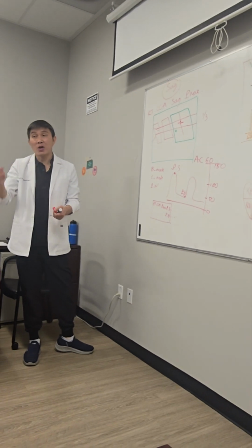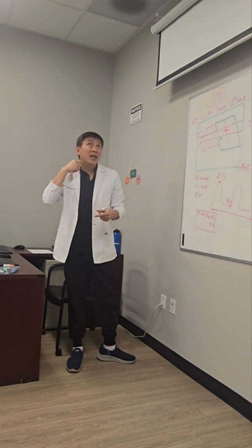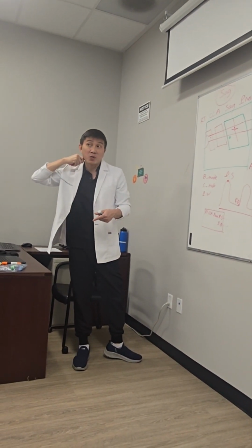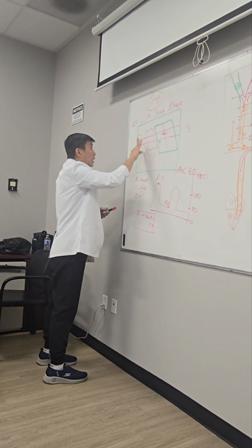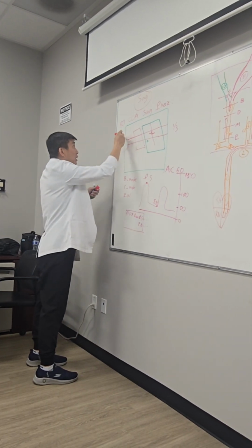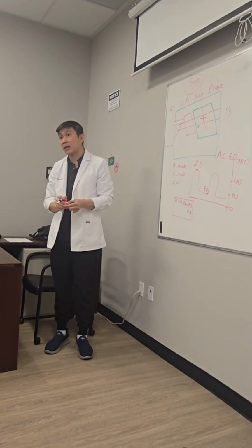But in some cases, I know for the beginner, it's really hard to do it, especially when you rock up one side of the transducer, pushing into the patient's neck. The patient will feel uncomfortable. So that's why it's acceptable, if you need, to adjust the color box this way. I believe it's going to be much easier for you for the distal CCA.